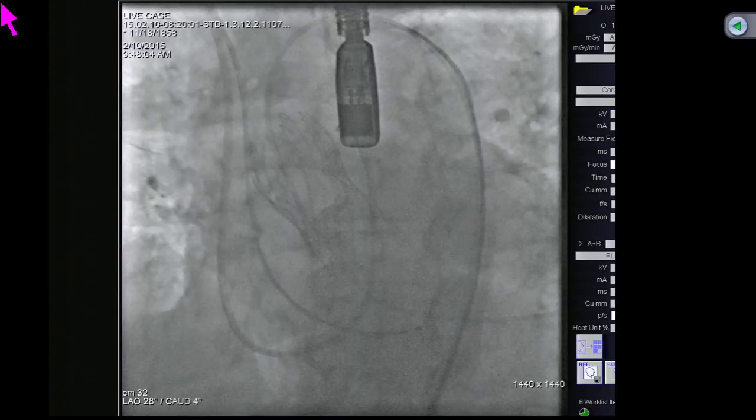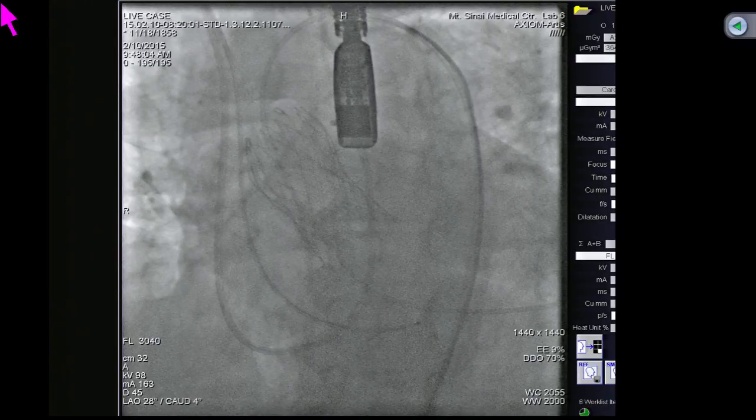Okay. Well, let's go and we try to see the hemodynamics now. So make sure on one side of the screen we show that. We have a right heart there. Particularly the gradient, PA pressures. Your pressures are okay? Good. Didn't change. Yeah. Well, very good. Actually, there is no gradient. Can you show the hemodynamic tracing?